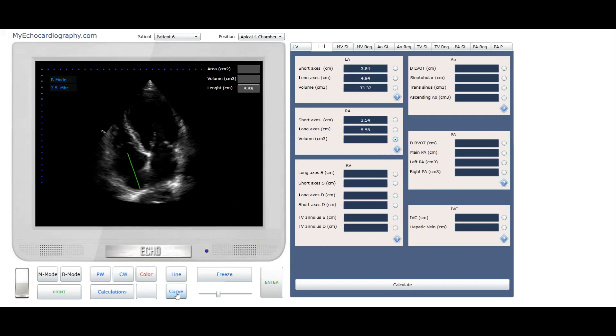Let's measure volume of the right atrium. Click the button curve. Place the points around inner wall of the endocardium of the right atrium. Click the button enter to save value.